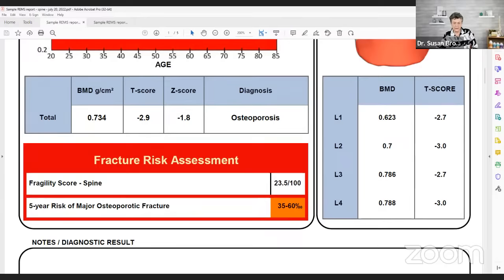The fragility score of the spine on this report is 23.5 out of 100. It presents like a percent — 23.5 — but when you discuss a fragility score, you say 23.5, not 23.5 percent.